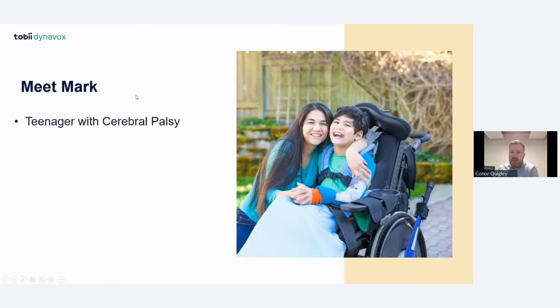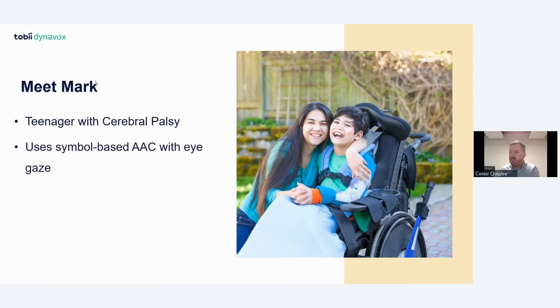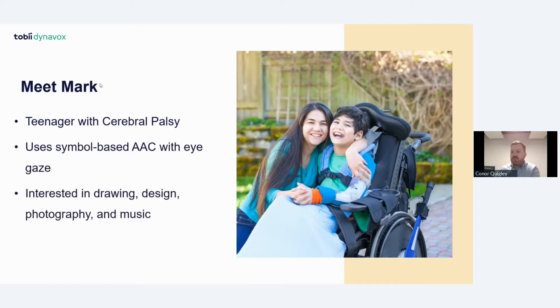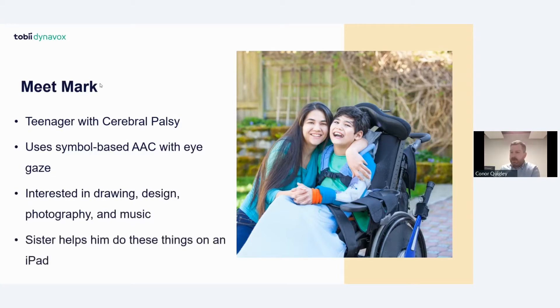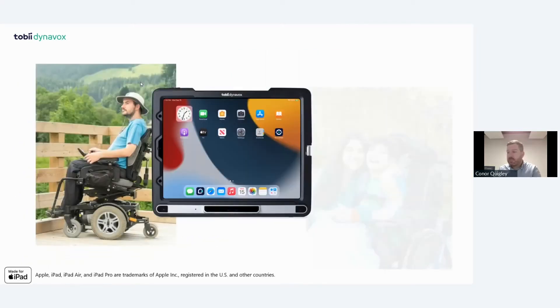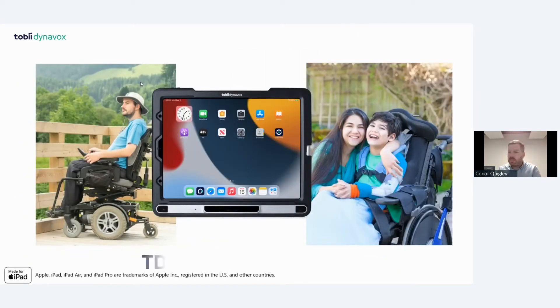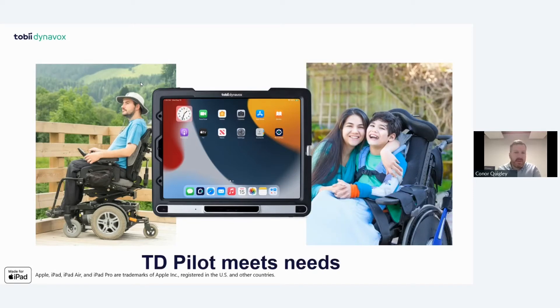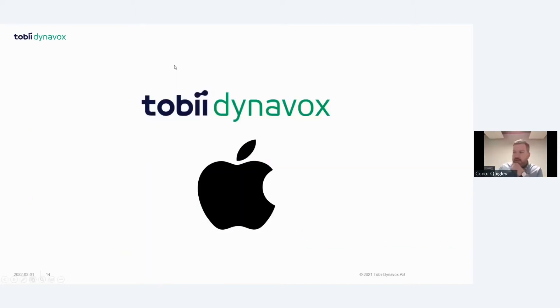Alternatively, Mark is a teenager with cerebral palsy who has been using a symbol-based AAC system with eye gaze since the age of four. He's interested in drawing, design, photography, and music, and currently his sister helps him do these things on an iPad. Ideally, Mark would like some independence to do these things himself, and the TD Pilot can meet the needs of both these users.